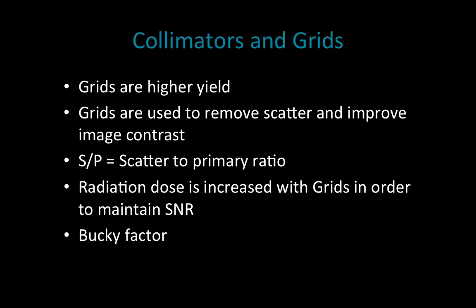The bucky factor is very important, and although it tends to correlate with the grid ratio, it is not the same thing. The bucky factor is defined based on the radiation dose when using the grid versus without the grid — essentially incident x-rays over transmitted x-rays. So if you have a very aggressive grid that limits the amount of transmitted x-rays, your bucky factor is going to be higher, which means the patient receives a higher radiation dose.